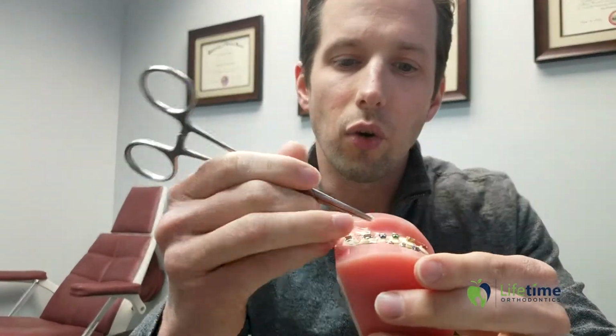Some other goodies we have in here are some O-ties, okay? And that's what these little guys are for. Maybe an O-tie pops off and it's causing some discomfort. We have a bunch of different colors in here. All you do is take this little O-tie, okay, and this goes around the brackets. So I'll show you on here. We already have O-ties on here, but I'll just put one over top of them, okay?